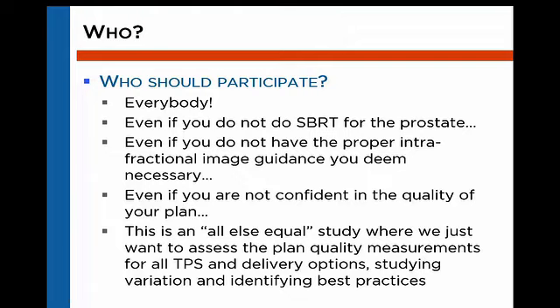It's an all-else-equal study where we really just want to assess the plan quality, and we're not going to rule you out because you don't have the proper image guidance yet. We're trying to learn which systems, which planners, which planning systems can produce a very high-quality plan.